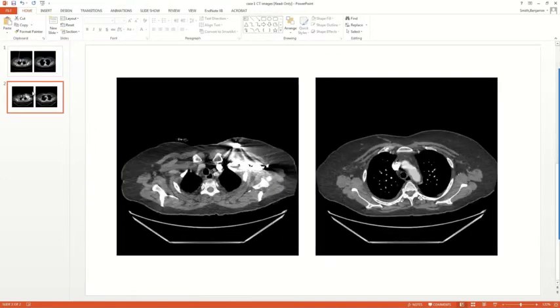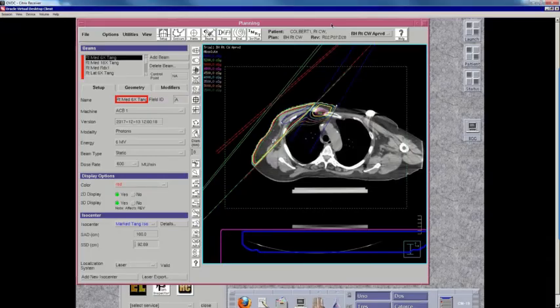Is this after chemotherapy, Lauren? Mm-hmm. So again, this patient didn't get a lot of chemotherapy, but she had a great response. She's got almost nothing left in her axilla. You can see no infraclavicular disease. You can kind of tell that the chemo took a toll on her, so she's developed these small pleural effusions. So she had a mastectomy and had this amazing response to chemotherapy and had a pathologic CR. And so here's her plan.